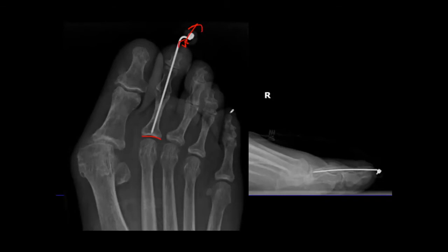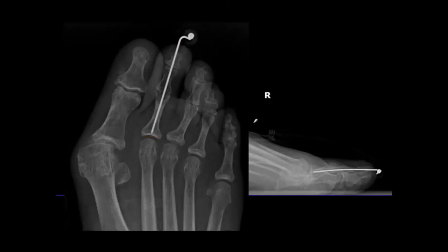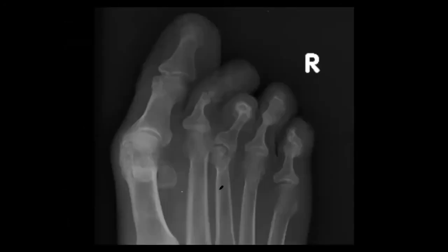Someone mentioned ossification of the fifth metatarsal head — what do we think this is? Not really sure — possibly an accessory bone. Actually, it looks like there may be two of them. Anyone want to take a shot? This is the last of the toes.